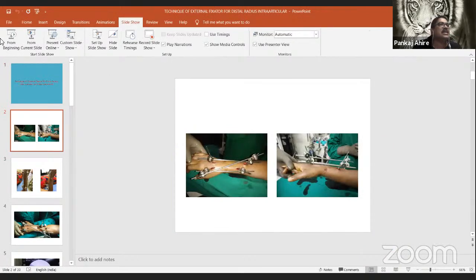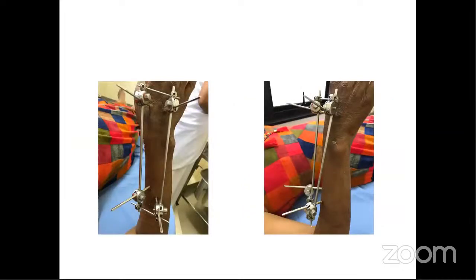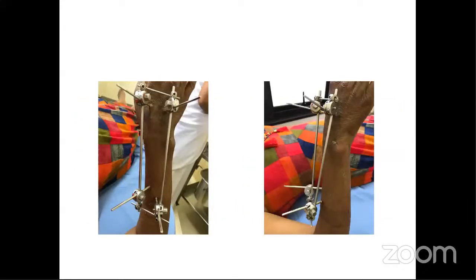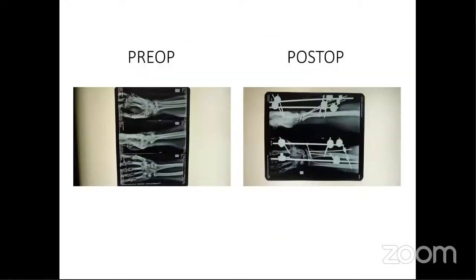You need to start slideshow. So this was this case. This is our basic technique of fixator. I showed that previously. We either augment it with a cross rod or we make it a square frame to be more stable, like this. This I have shown you. This was that case I showed you, intra-articular depression.